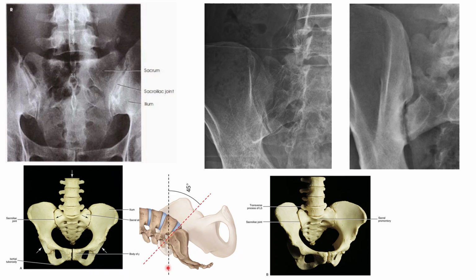In this video, we will be looking at the SI joints. So the first image that I'd like to talk about is the AP axial SI joints. The AP axial SI joints require a 30 to 35 degree cephalad angulation of the central ray.